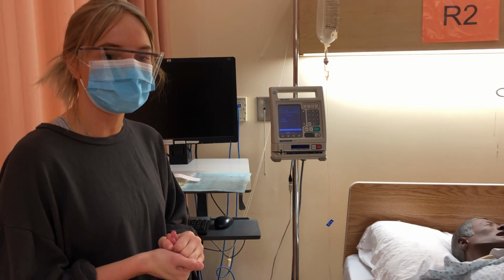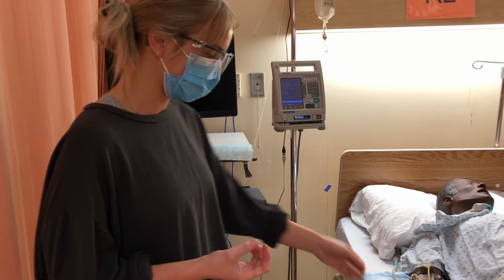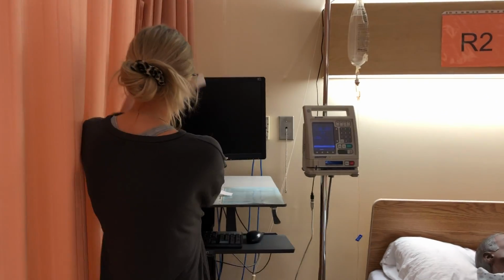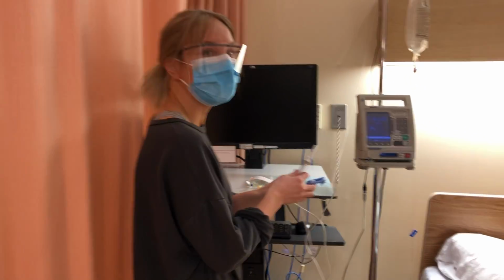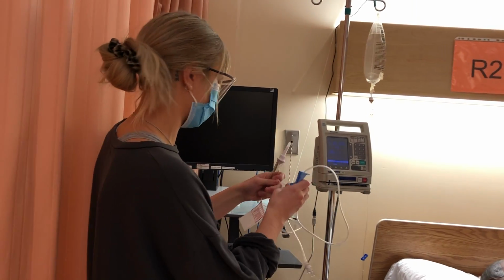And also, I would get my nurse to bring me a flush to flush the patient's line before I do this. So first I'm going to put the medication into the pump. Have a flush. And then I'm just going to hit start. Okay, so I'm just clamping, making sure everything's clamped.